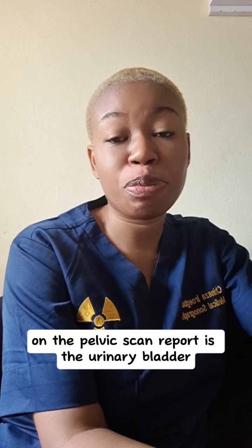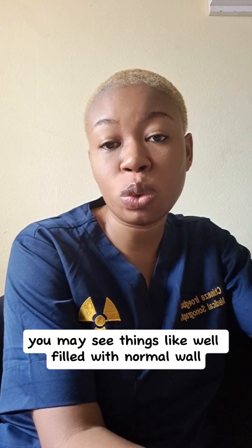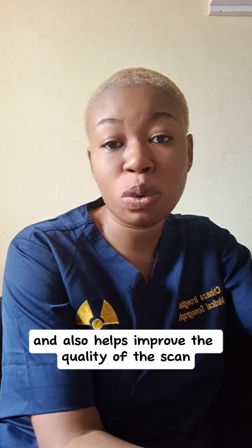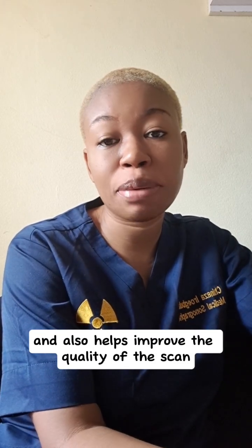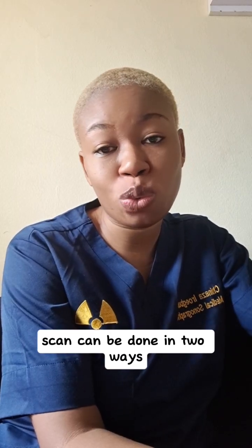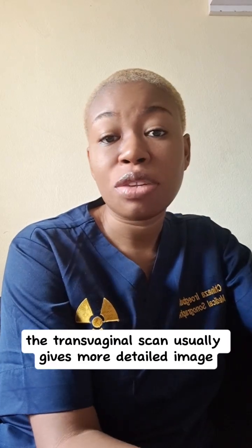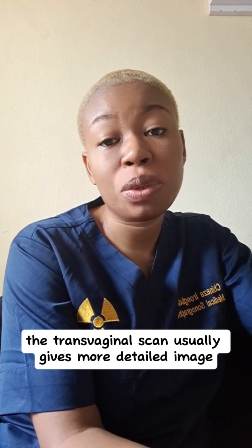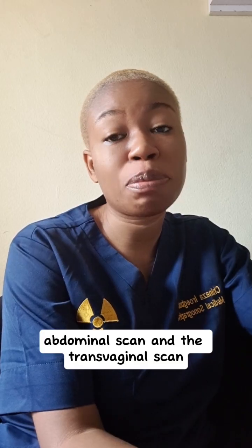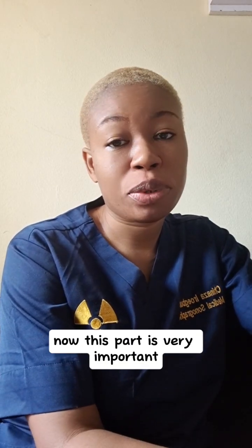Finally, on the pelvic scan report is the urinary bladder. You may see things like well filled with normal wall. This tells you that the urinary bladder looks fine and also helps improve the quality of the scan. It is also important to know that pelvic scan can be done in two ways, through the transabdominal process or transvaginally. The transvaginal scan usually gives more detailed image, but both the transabdominal scan and the transvaginal scan give the same information.